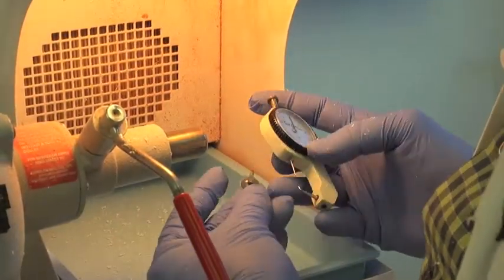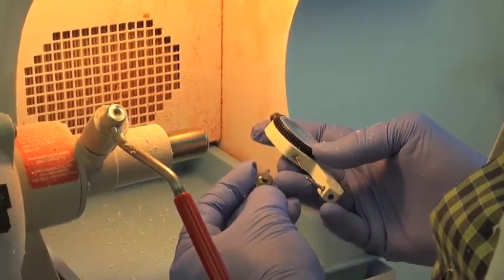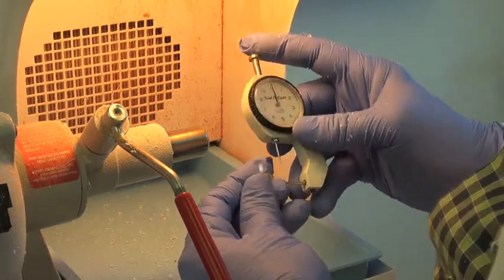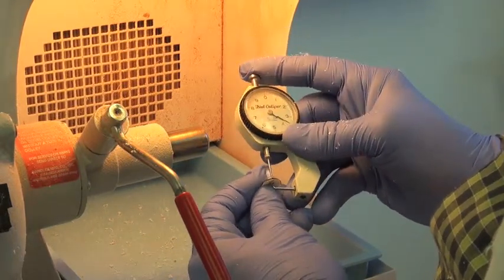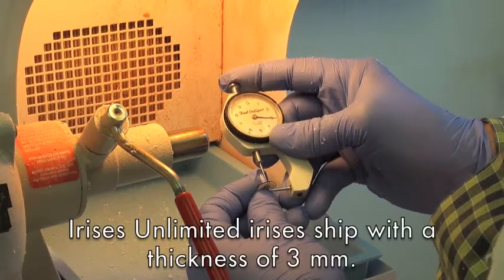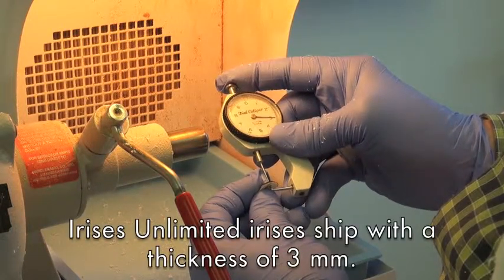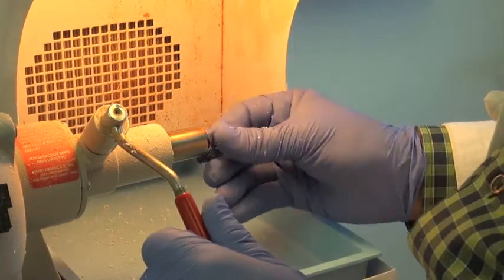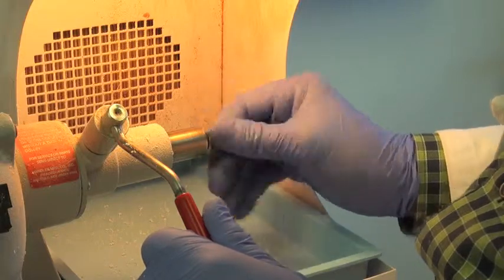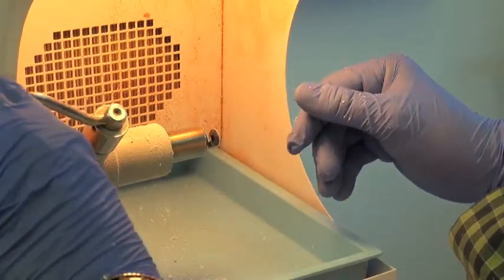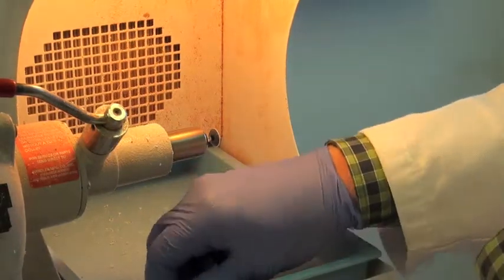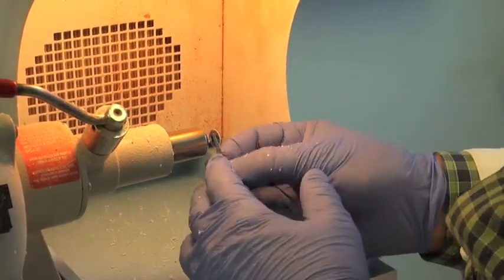This is a standard Irises Unlimited image as you will receive it as a customer. It comes to you with a thickness of three millimeters. And on the thinnest of prosthetic eyes, you may need to thin this to give yourself room to embed it in the prosthesis. And that's what I'm trying to show you is how we can adjust this and make it as thin as possible.